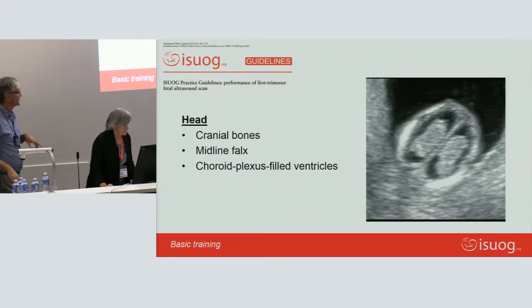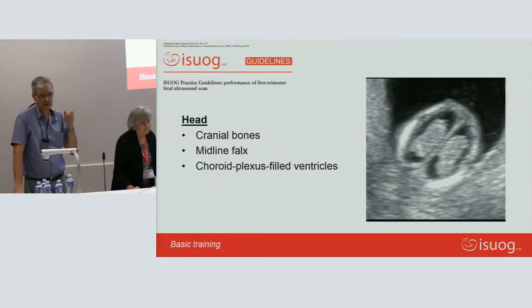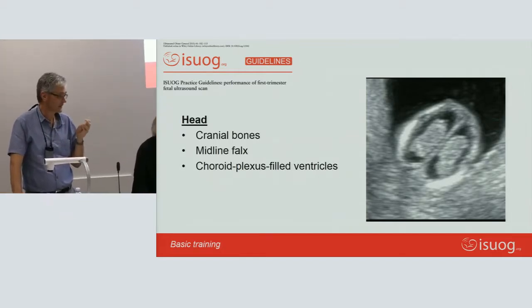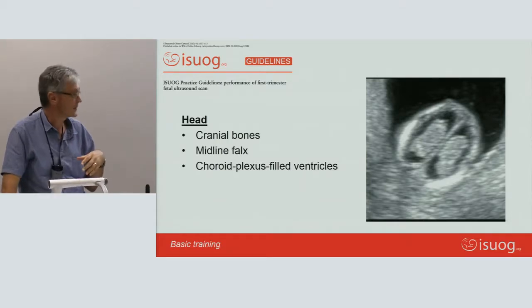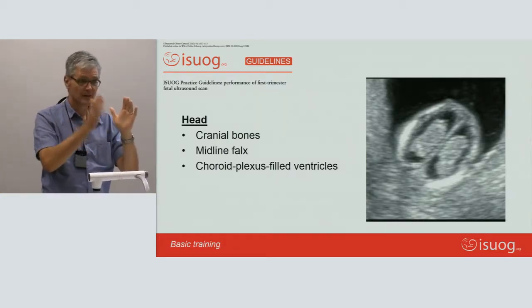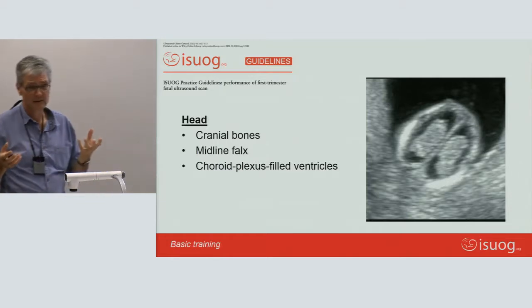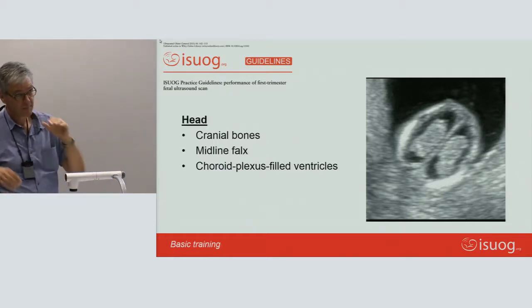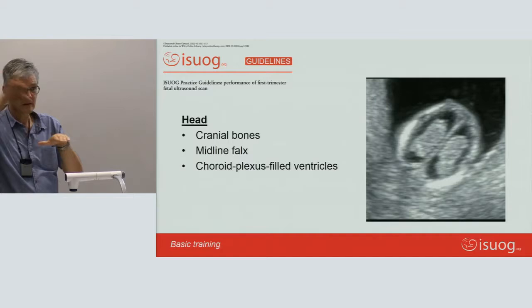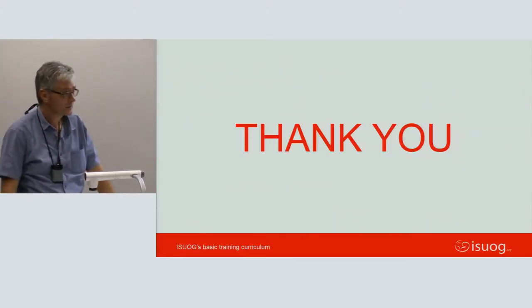Anyway, while you're sorting that out for us, if you don't see the falx in the middle, either the falx isn't there, and then we'll come to what the reason is for that, or if the falx doesn't run nicely down the middle, chances are that it's basically your fault and not the baby's fault, that you're scanning through the head obliquely and not axially.